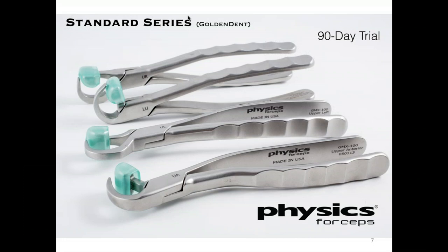It works second molar to second molar, upper and lower. And this is going to be the easiest set to use. We do have one more set that goes further back into the mouth that I'll show you next. I don't think we covered it on the webinar this evening, but that's more of an adjunct to this set. Most doctors are just happy with the standard series.